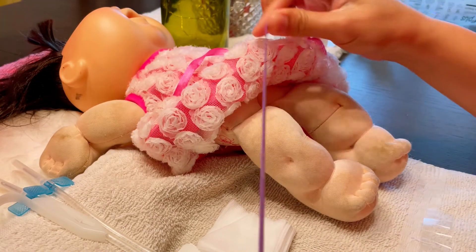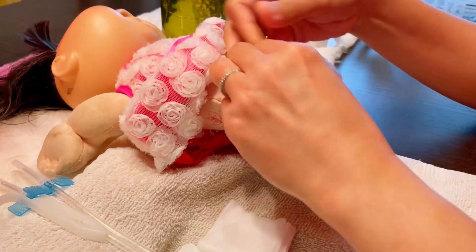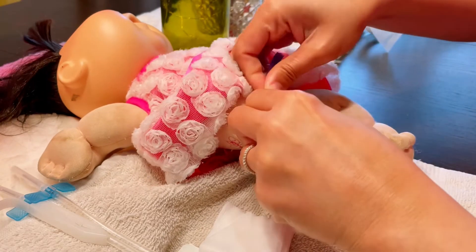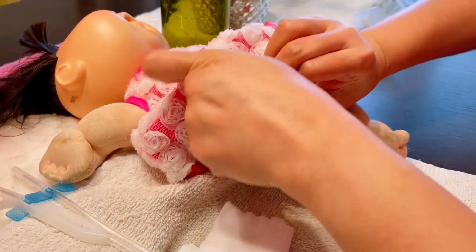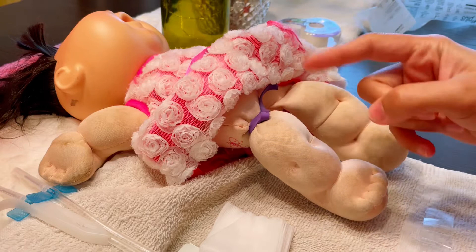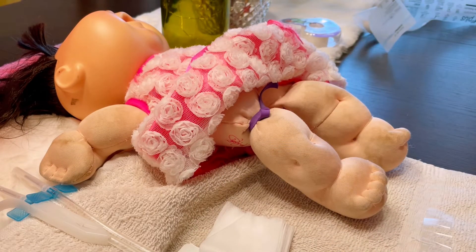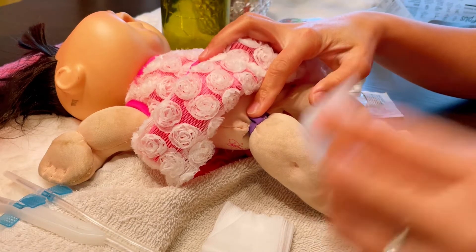Next, we have to apply the tourniquet. The tourniquet is a tool that acts as a guide for you to cannulate the patient, and also if the patient's access moves around like a worm, the tourniquet will help secure it.